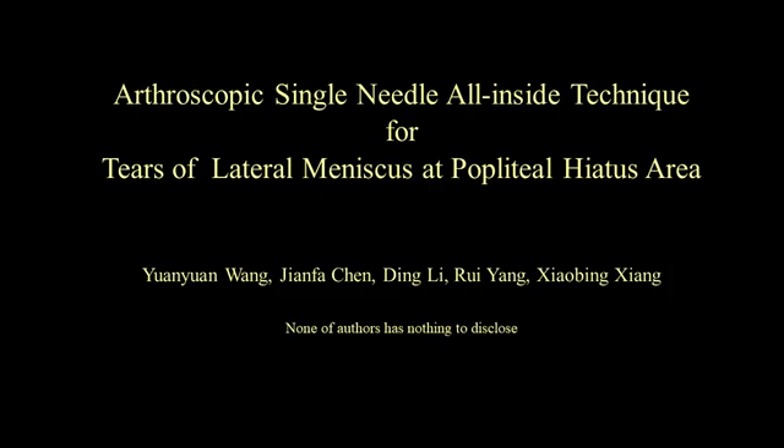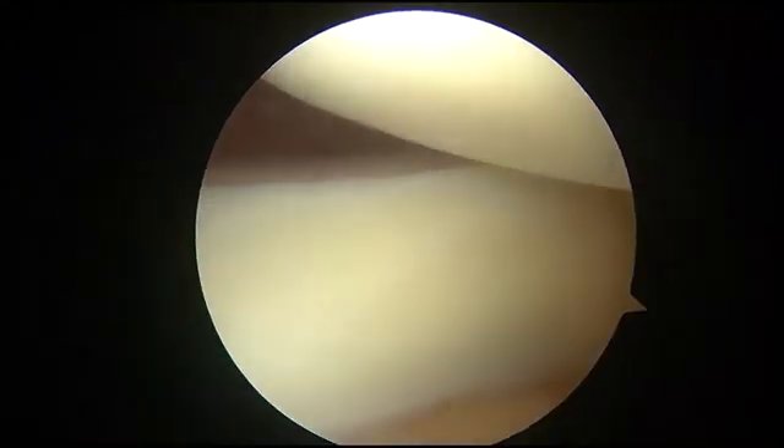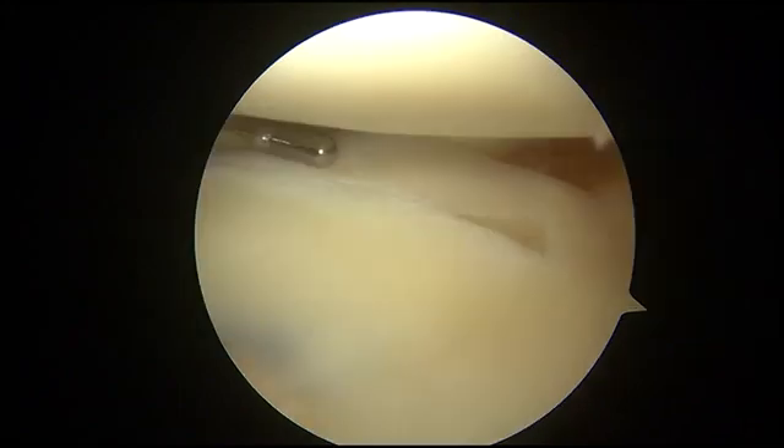All authors have nothing to disclose. Operations in this video were performed in the left knee of a 28-year-old male. Instruments are introduced in the joint through the anterior medial portal, with the arthroscope routed through the anterior lateral portal.